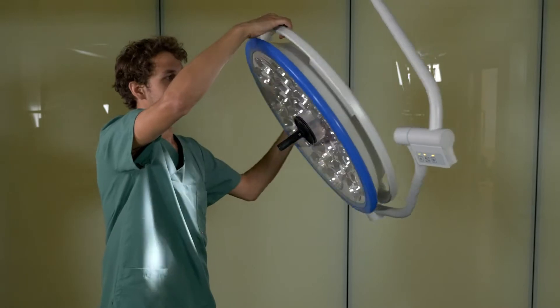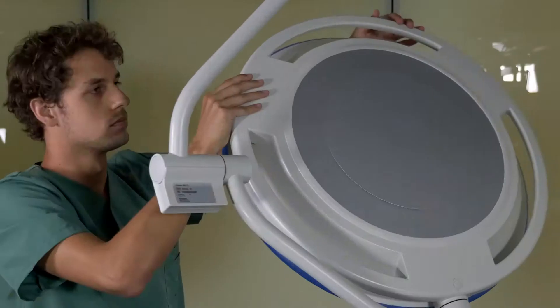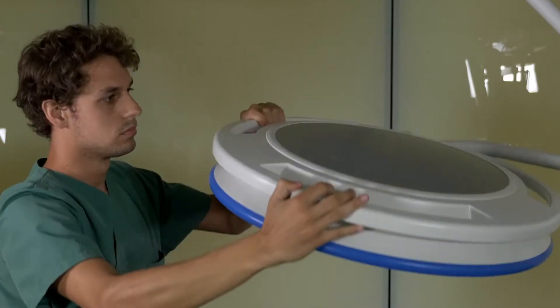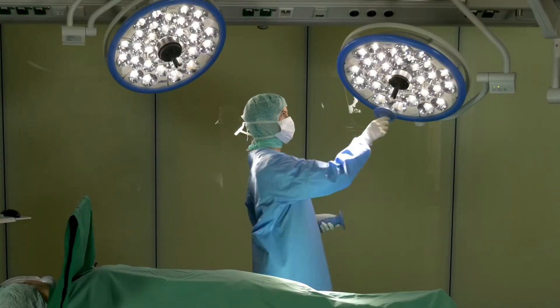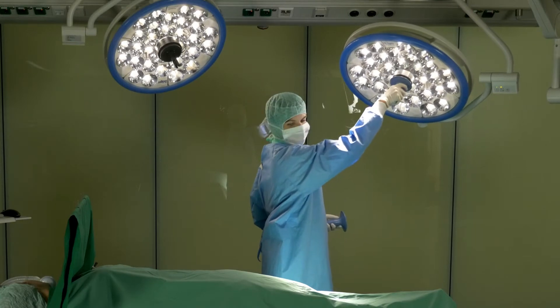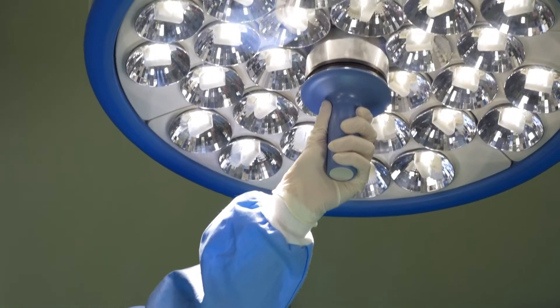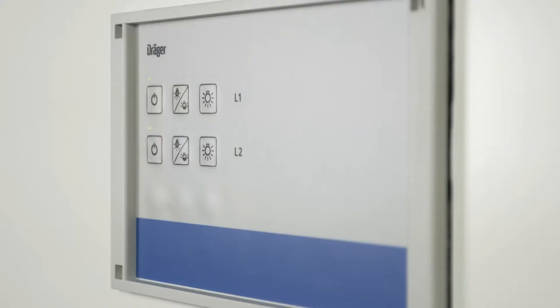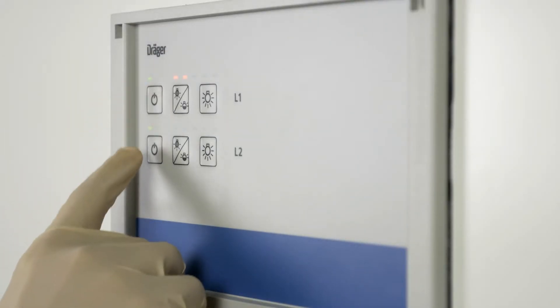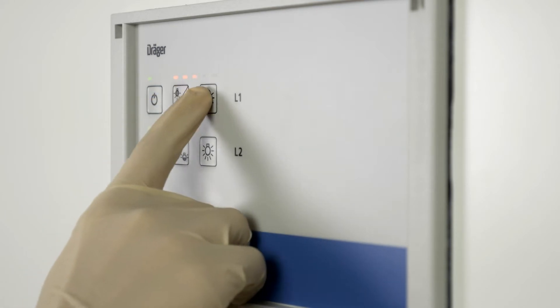Being freely movable into all directions, the light can easily be positioned exactly as and where you need it. The sterile personnel are able to direct the light and adjust the size of the light field with only one hand using the central handle. Ease of use is guaranteed with a clear operating concept reduced to the essentials.